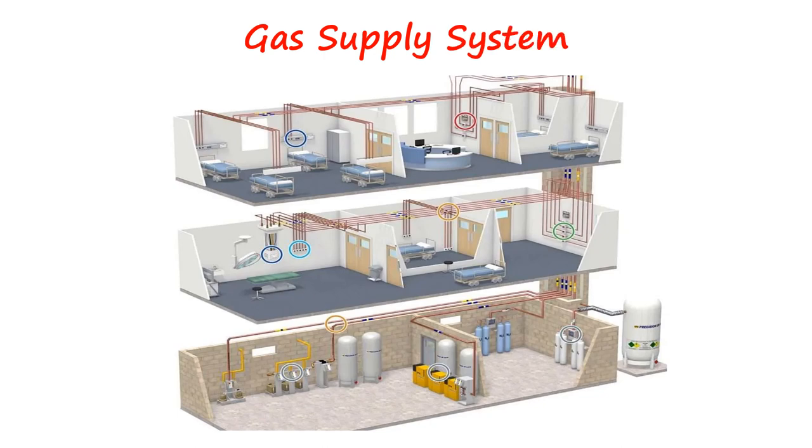Medical gas supply system includes cylinders and pipeline system. Cylinders are containers that store gases in either gas, liquid, or both states, depending on the physical properties of the gas. These properties and their clinical implications will be discussed in the subsequent video series.